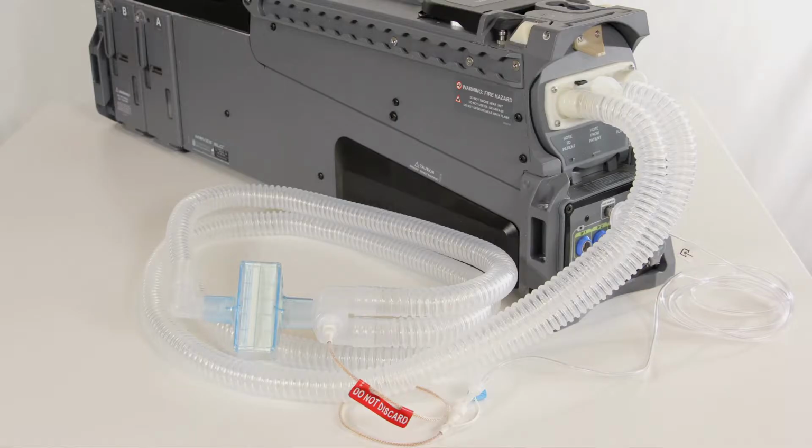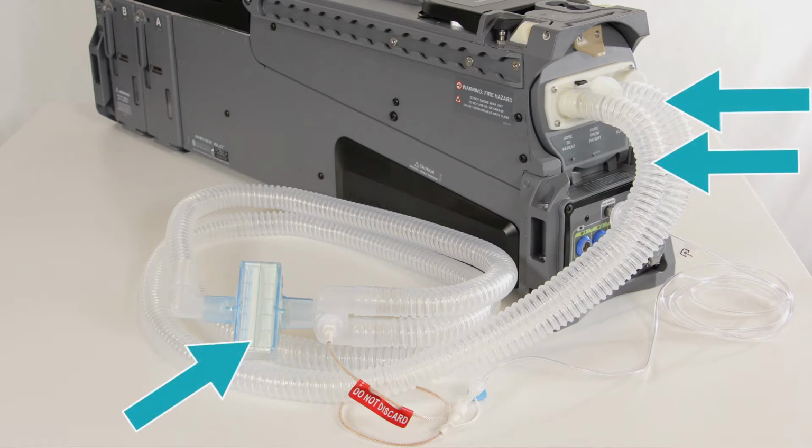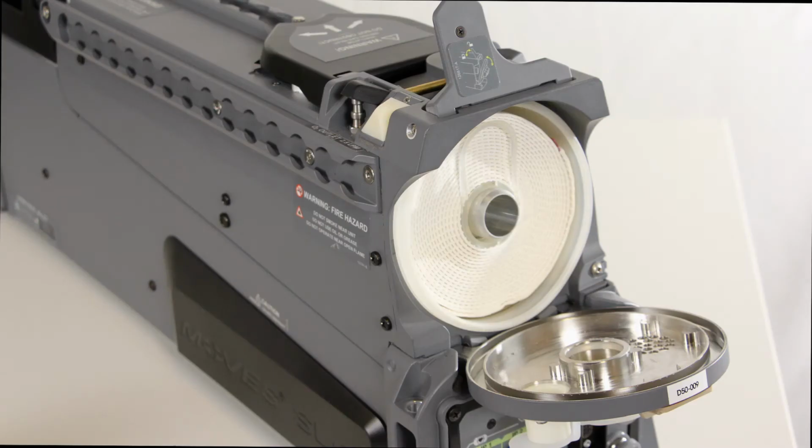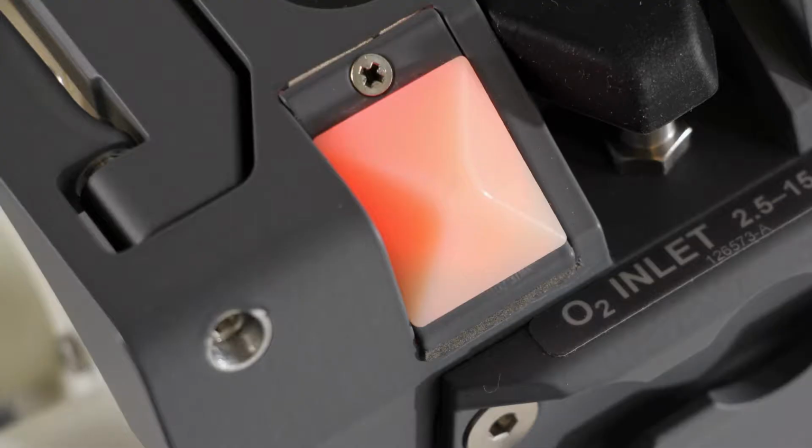The cartridge is for use with the ventilator breathing circuit, which includes the ventilator hoses, the patient filter, the endotracheal tube connector, Nafion tube, and the sampling line. The cartridge is also for single patient use only. It should be discarded when an audible or visual alarm is triggered, indicating a high level of CO2 on inspiration.